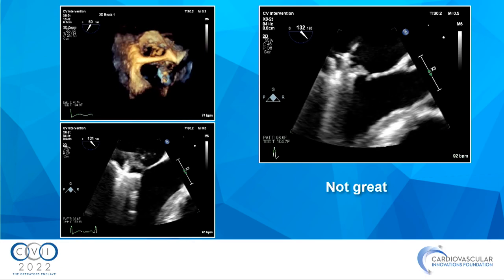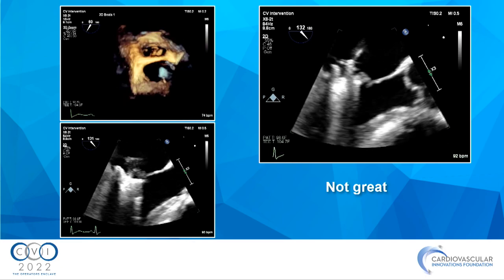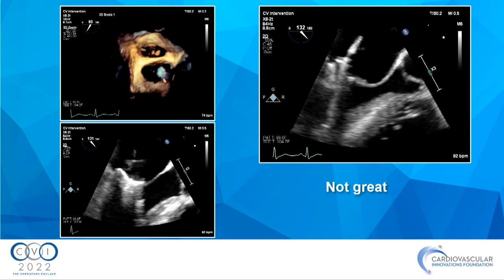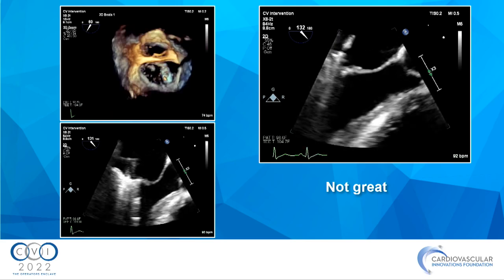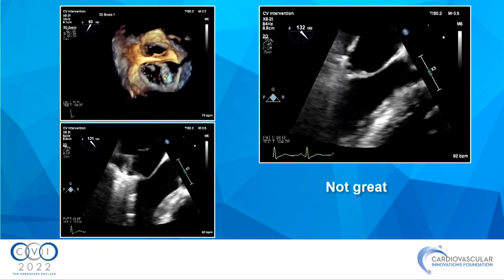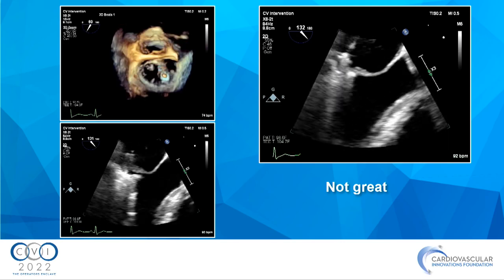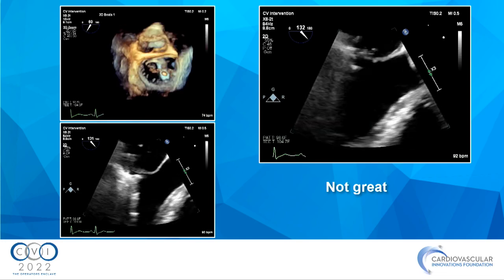And did you go for the pathology, or did you think, let me start a little? Honestly, I started for the pathology, like top left, and then I let this go, and I thought, well, maybe I'll just try a zip. Yeah. Zip was hopeless. Really? It just didn't work, because wherever I grabbed next to it, the gap height didn't change, because the papillary muscle was just taking everything into the left atrium.